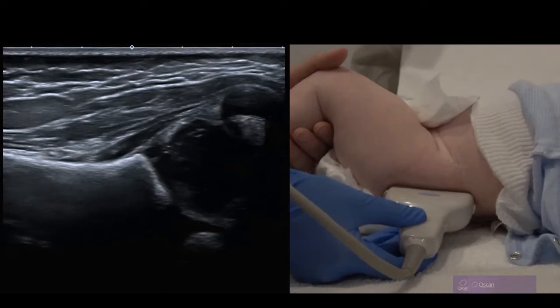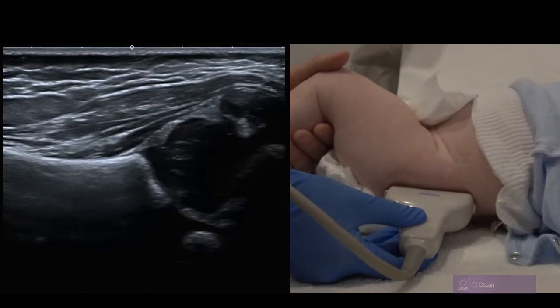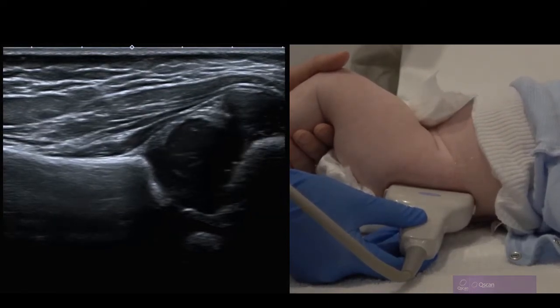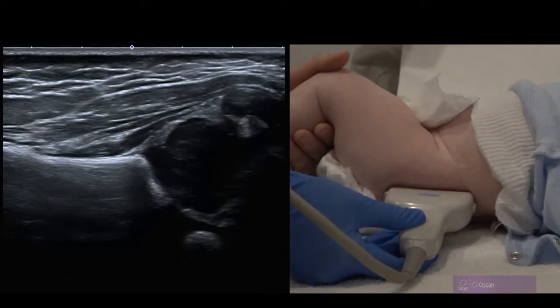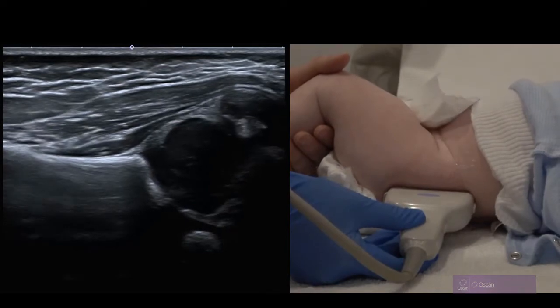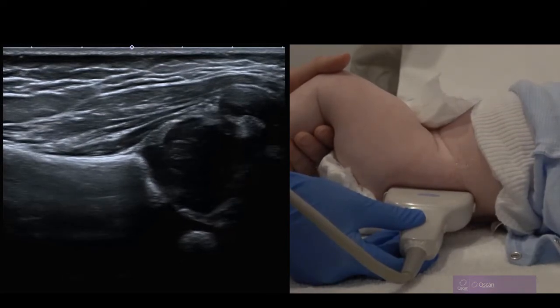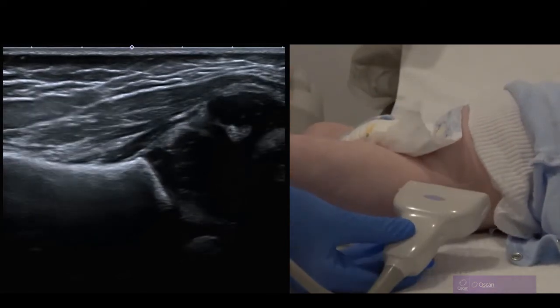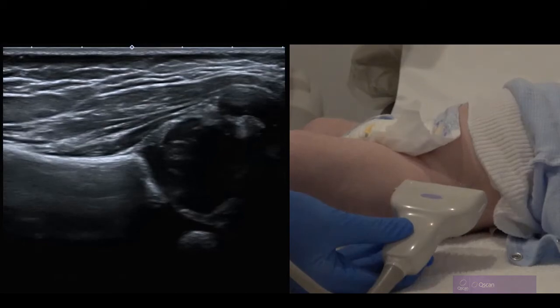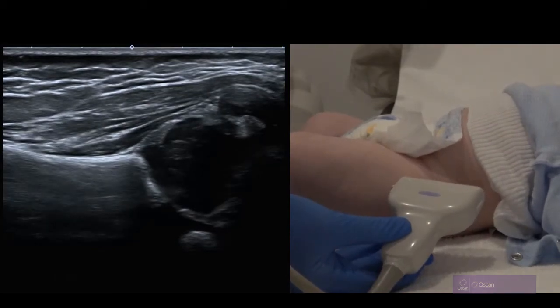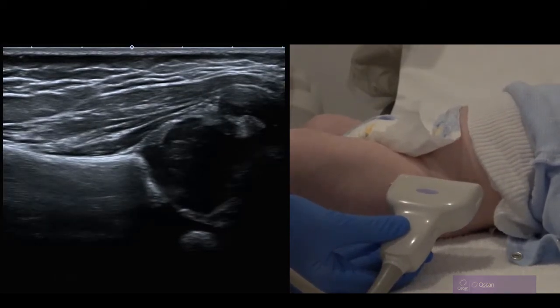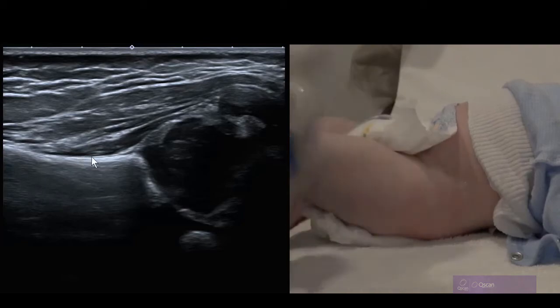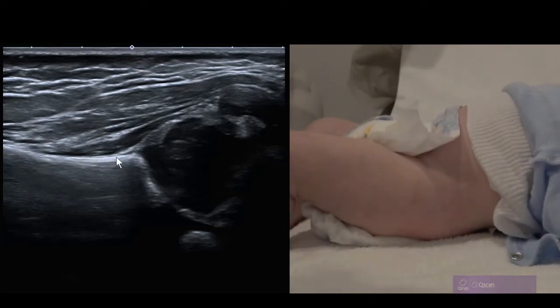With slightly more pressure on the lower end of the transducer, the bony roofline is now more reflective. You can see the femoral head to the right of screen. The anatomy that must be understood in order to perform Graf angles is the ilium and the bony rim.